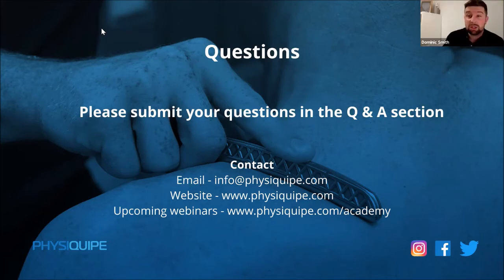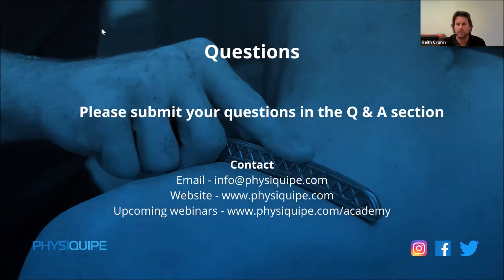Okay. So literally 5 to 8 minutes, onto the whole area? Whole area, that would get down that whole leg into the foot. It also gives you a chance to talk. I use that time to say, how are things feeling? You just incorporate the two together because the person's just sitting there. That way you maximize the use of your time.